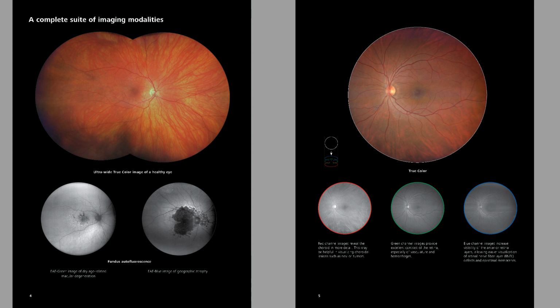You can see if the patient isn't pressed up against the device. You can actually do a proper lid lift with this instrument if need be. And you do all that before you expose the patient to visible light. So before you sweep your optics through the patient's eye, you see that you are properly aligned and that the image you capture is going to be a valuable image. And so this really cuts down on the number of recaptures required to get good images from this device.